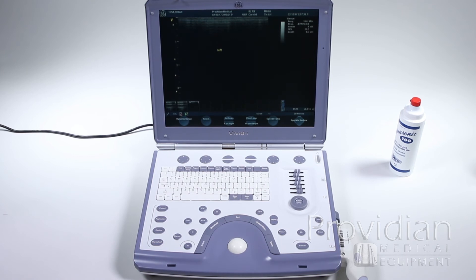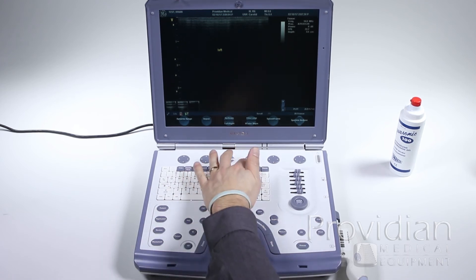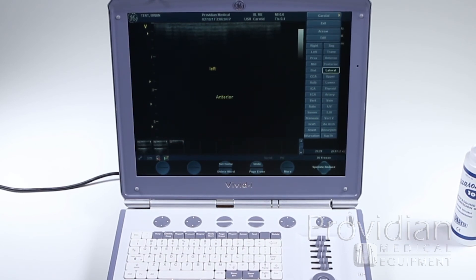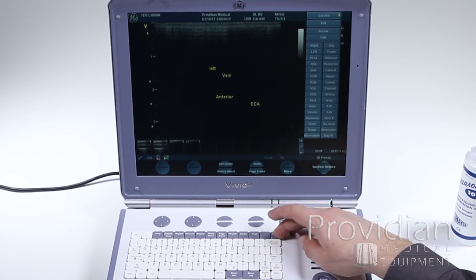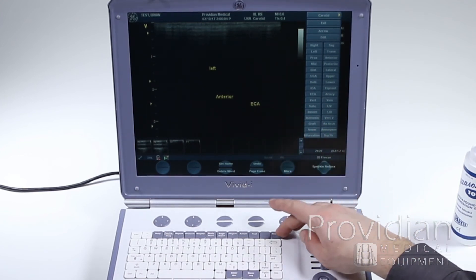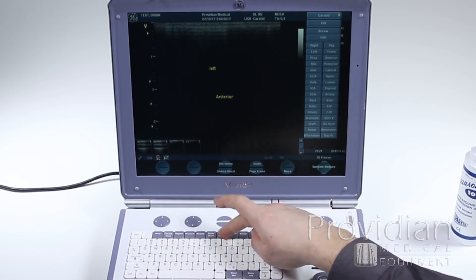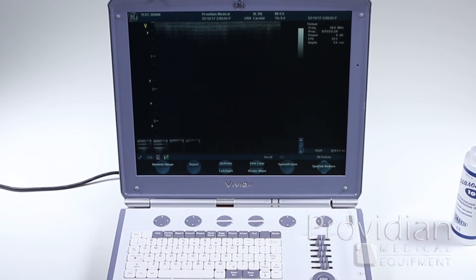If you want to see the annotation library — which can be assigned in system setup, covered in the system setup chapter — hit the text key and that gives you a pre-programmed library of everything available. You can choose options like 'anterior,' select them, and put them all over the screen. Hit store to save. The delete key removes the last annotation added; if you want to clear all, use page erase to remove everything on screen.